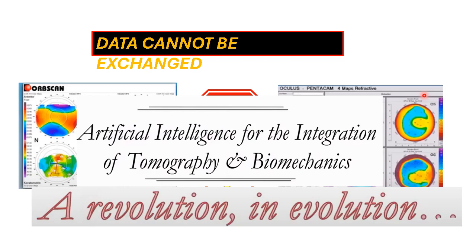One of the aims of this technology is to make a unifying system that can collect data from different sources and interpret them by the process of machine learning or deep learning, and then display this information and help in the early detection and diagnosis of the condition regardless of the source of the data or information.